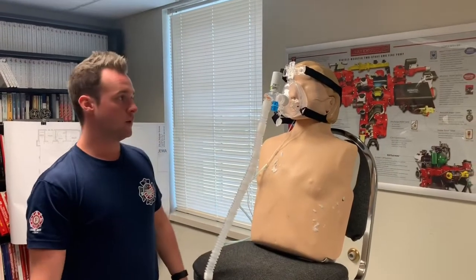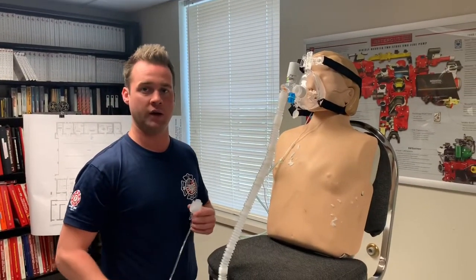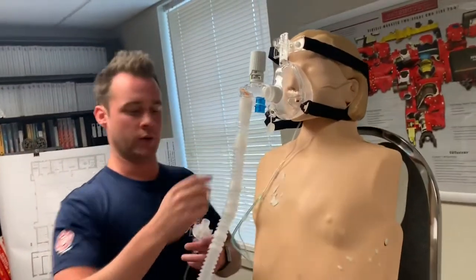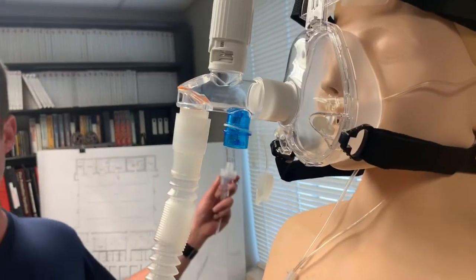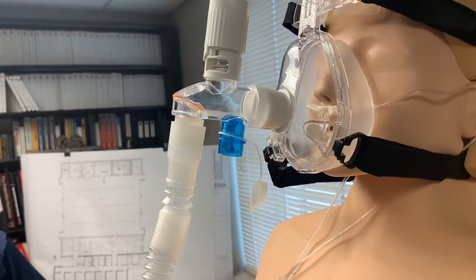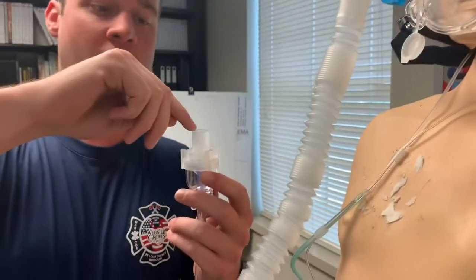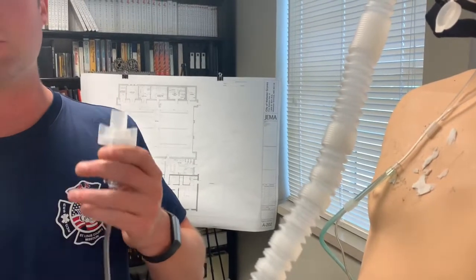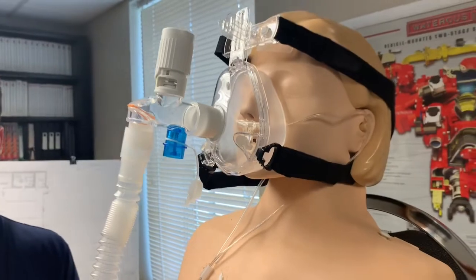Okay, so some patients, when we put them on CPAP and we're not seeing the improvement that we want, we can administer nebulized medications. This connection right here is where we would hook up our nebulizer kit. We would need a second bottle of oxygen. We will squirt the Proventil and Atrovent into here, and you want to set the oxygen bottle at 6 liters per minute because that aerosolizes it the right amount.